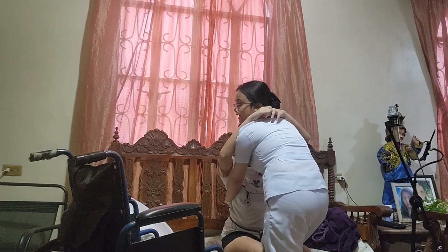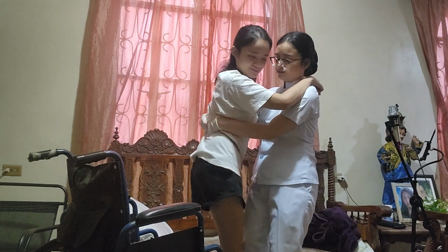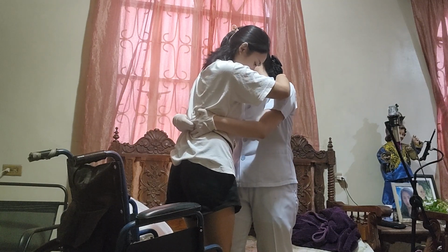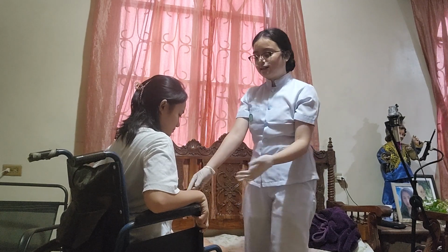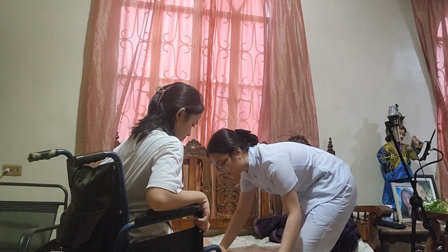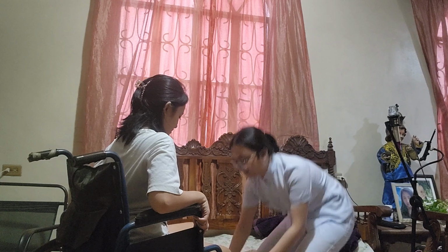The patient to stand and put her on the wheelchair. So, ma'am, 1, 2, 3. Nararamdaman niyo na po ba yung parts sa wheelchair? Then, just like that. And then, of course, you will need to bring down the foot support, and then place the patient's feet on them.